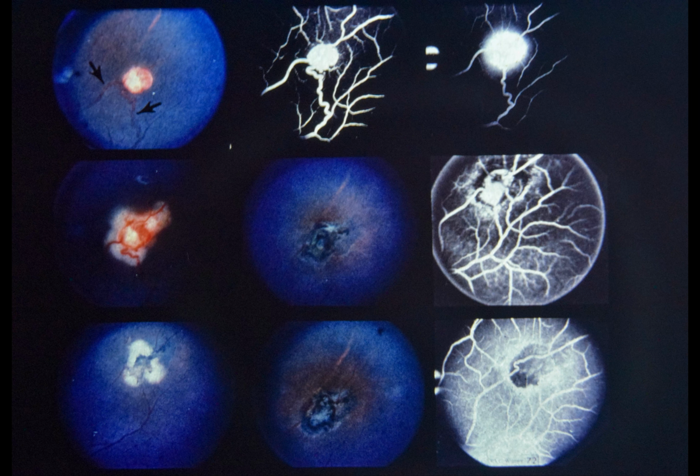Upper center, note that tumor fills rapidly with dye. Upper right, note dye leakage into retina 10 minutes after injection. Center left is a photograph taken immediately following xenon arc photocoagulation. Directly center, note circumscribed chorioretinal scar 3 months after treatment.